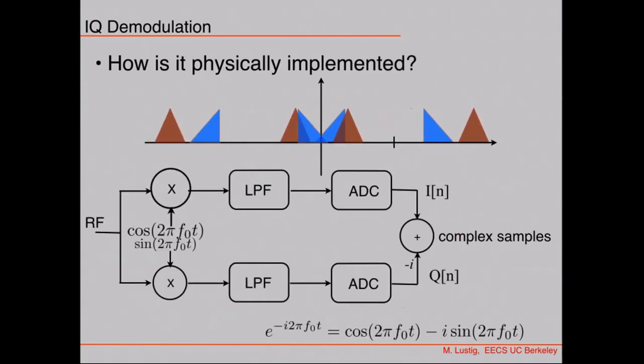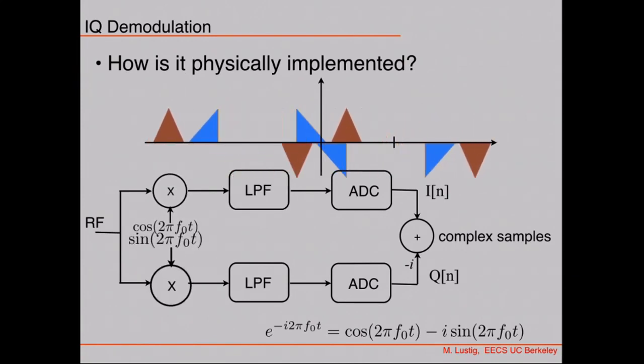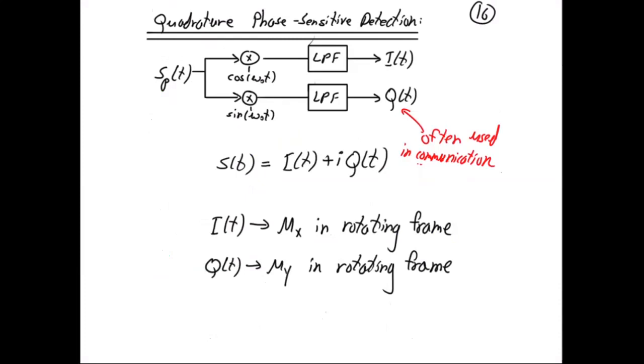I have a question about slice encoding. When we're doing slice encoding, as I understood, we are not changing the gradient itself, right? We are changing the center frequency of the RF signal. Is that what we are doing? Well, yeah, the gradient center doesn't change.